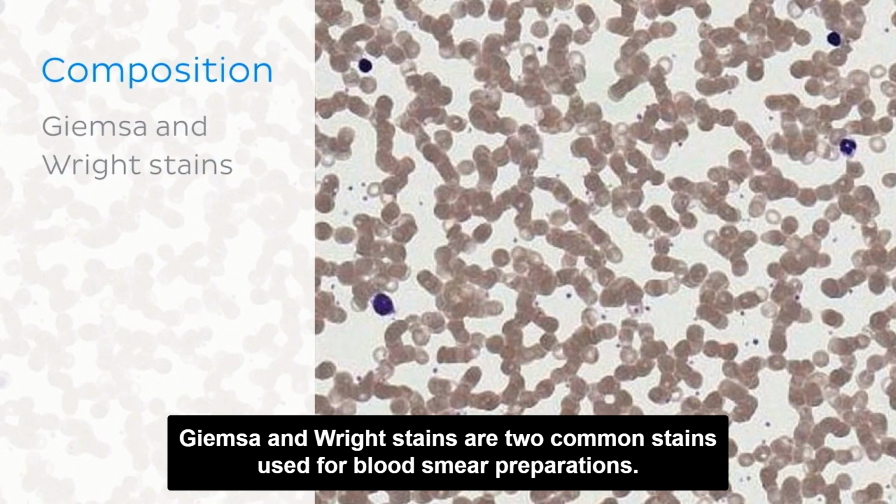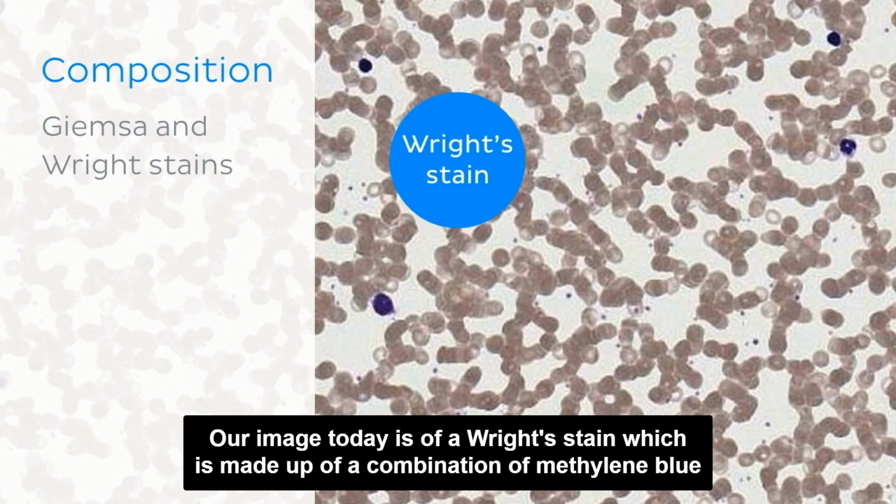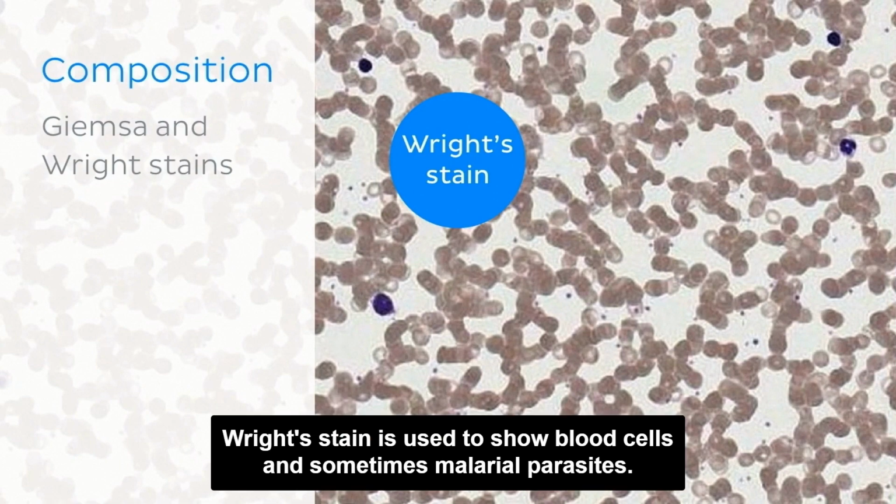Giemsa and Wright stains are two common stains used for blood smear preparations. Our image today is of a Wright stain, which is made up of a combination of methylene blue and eosin. Wright stain is used to show blood cells and sometimes malarial parasites.